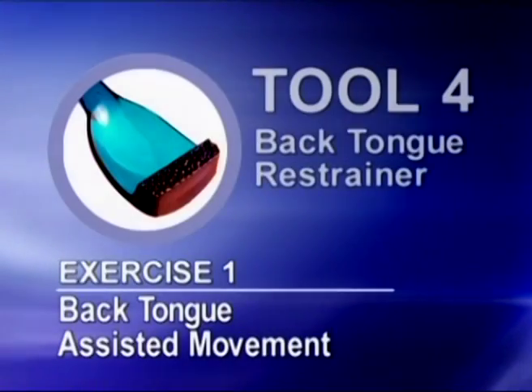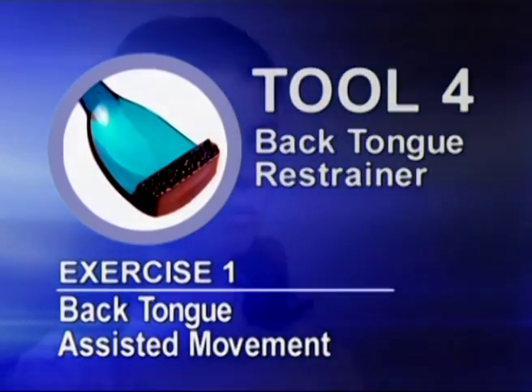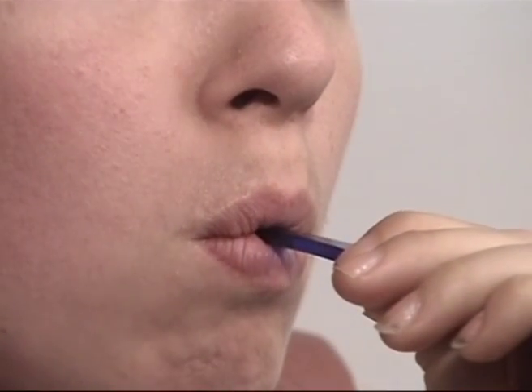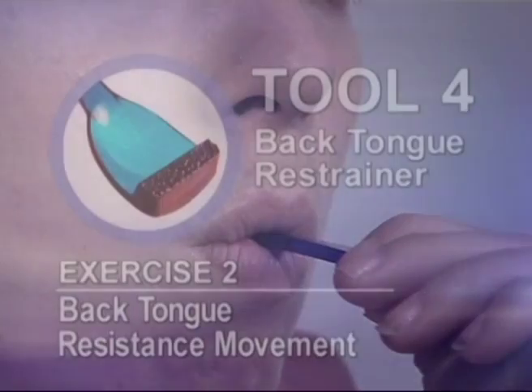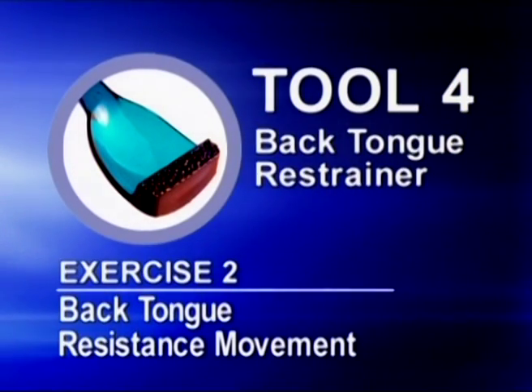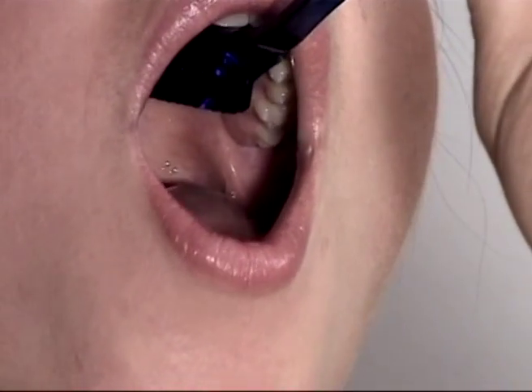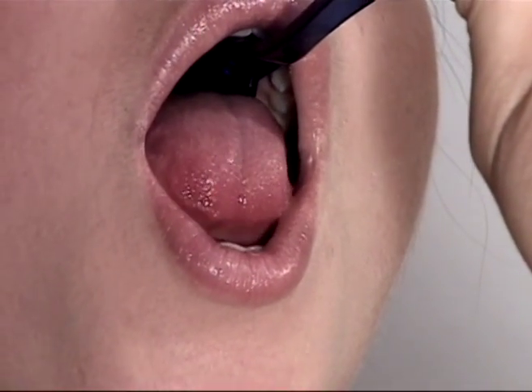The goal of exercise protocol 1 is to feel the ridge of tool number 4 against the back of the tongue. Place the ridge of tool number 4 on the back of the tongue to give the patient a tactile sensation of where the tongue should elevate, to the back of the palate. The goal of exercise protocol 2 is strengthening. Place tool number 4 on the palate behind the front teeth. Elevate the back of the tongue against tool number 4. Maintain elevation as long as possible. Record time of elevation in number of seconds.